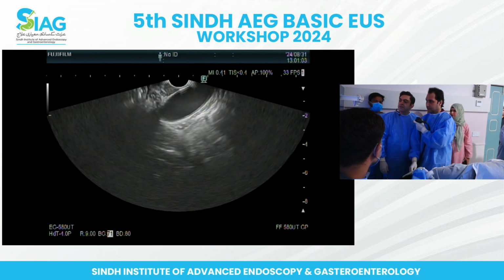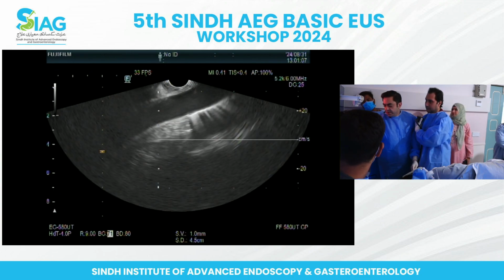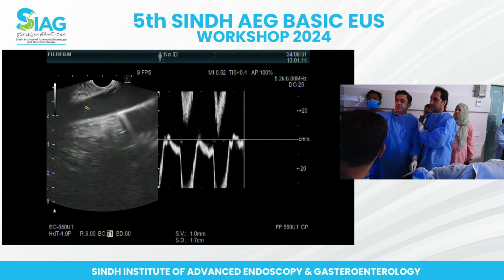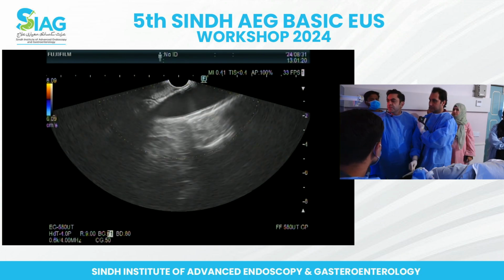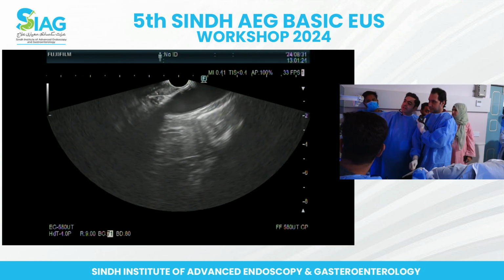Excellent. So you've got a good idea where the aorta is. If you want to confirm it, you can check with the power Doppler. So you can apply that. That will give you an arterial flow, which tells you, yes, you are where you should be, okay? And obviously the flow there will be positive as well. Okay, excellent. So let's now move a bit down.